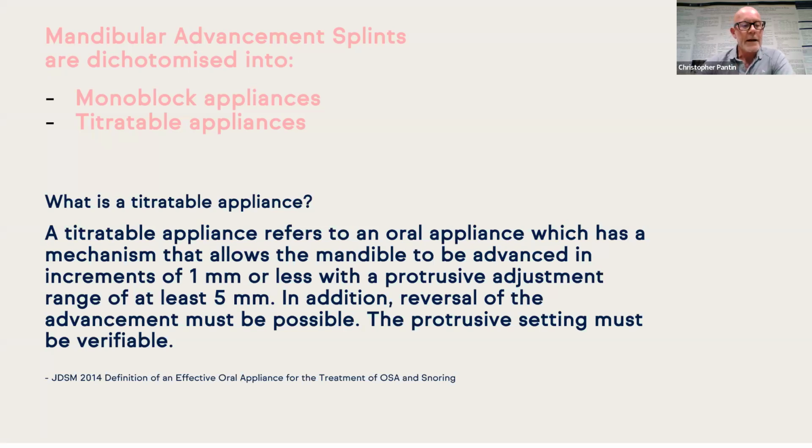Now, this came out from the American Academy of Dental Sleep Medicine in about 2014, defining what an effective oral appliance is. Of course, the splint that I patented completely is a disruptor against these dogmas.